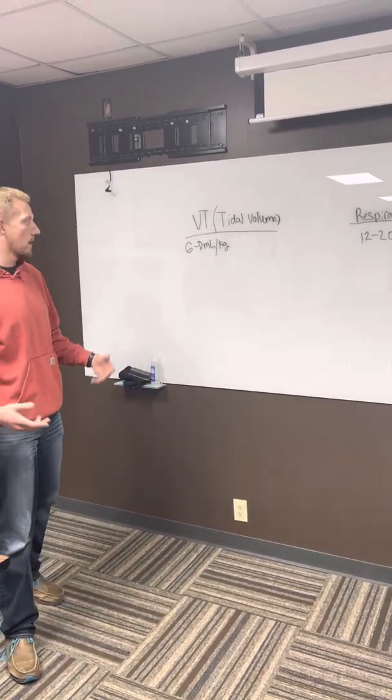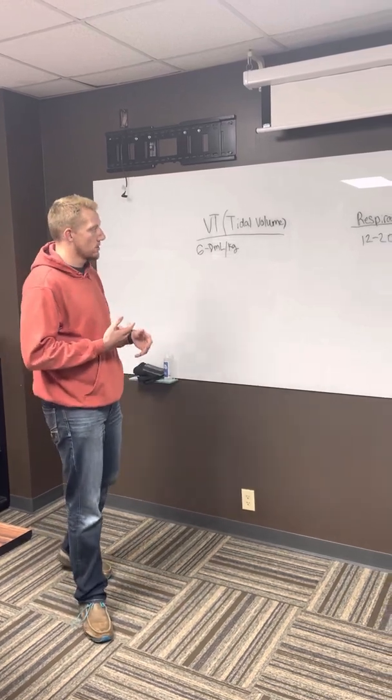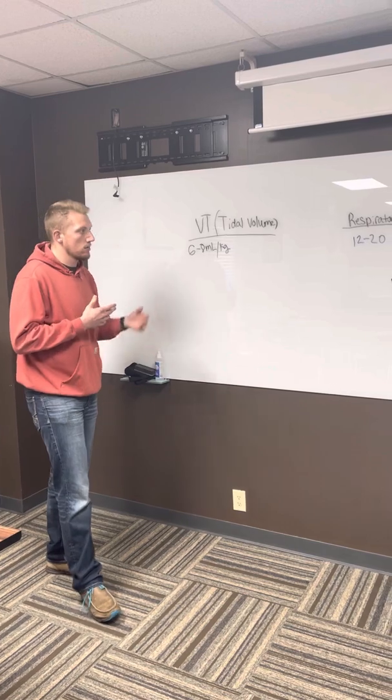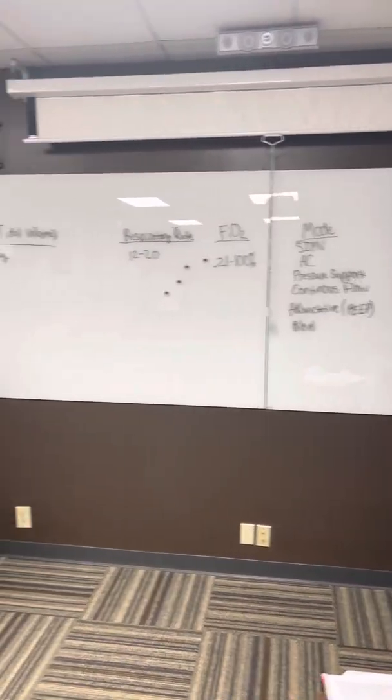All right, so I'm here today to talk about the settings of ventilators. The ones that the book talks about the most are your tidal volume, your respiratory rate, your FiO2, and your modes in which you would have a patient on.